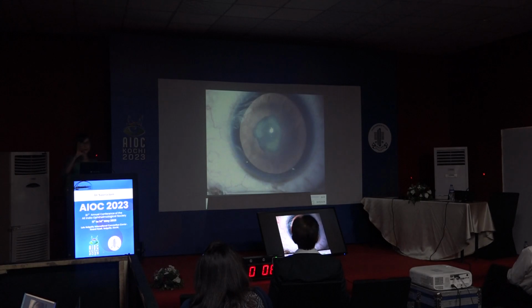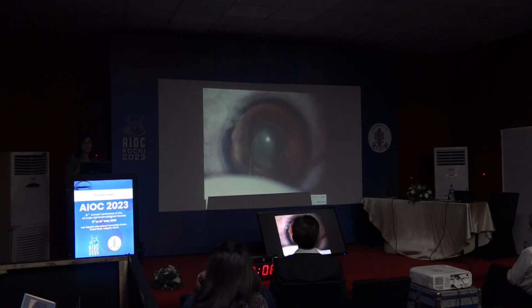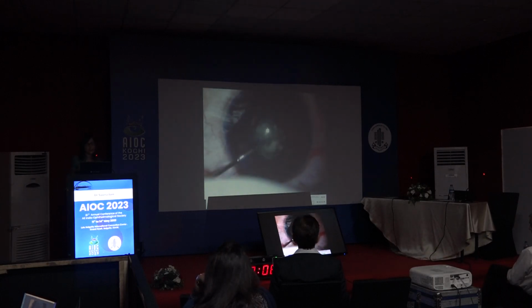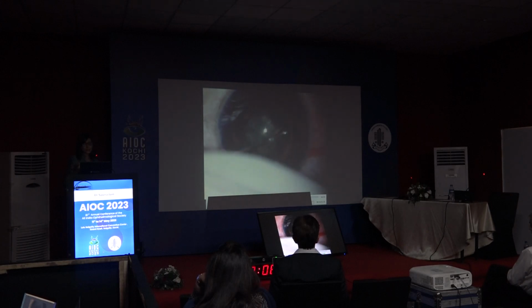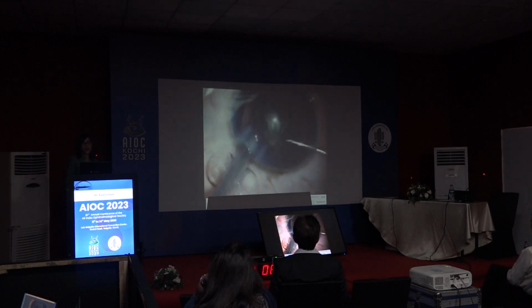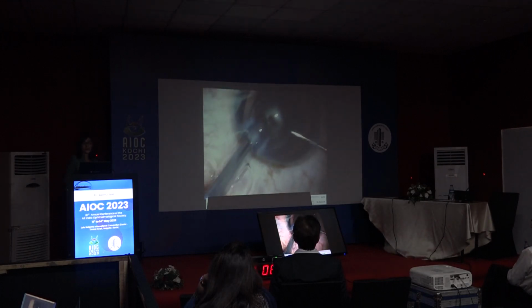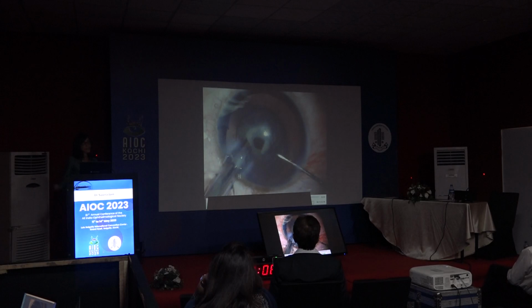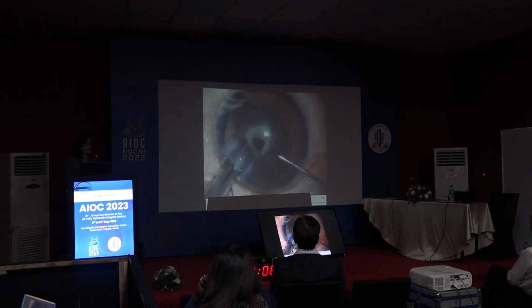Here's another case. This is a patient with a very soft polar cataract. And even despite doing everything by the book, a good, careful hydrodissection delineation is done here. And at the end of hydrodelineation and under viscoelastic, as soon as I put my probe in the eye, see what happens. I'm going towards the nucleus, and the entire PC opens up. Because it's so soft, I can see it flaying behind. And clearly it's a very soft cataract. This is the kind of opening. I've got my probe in and nothing has come out at all.